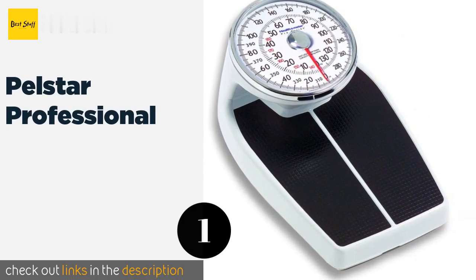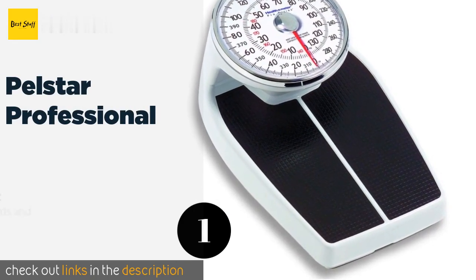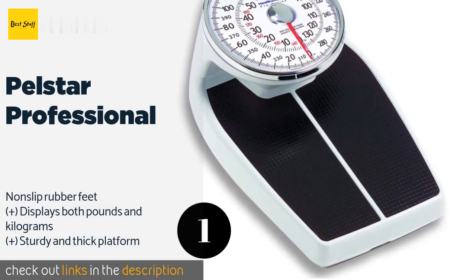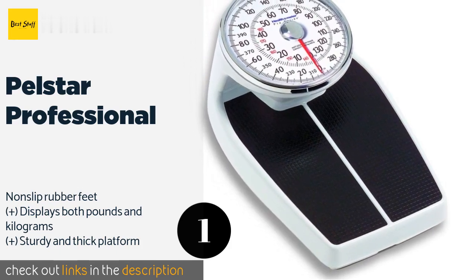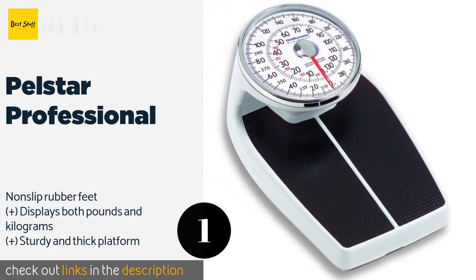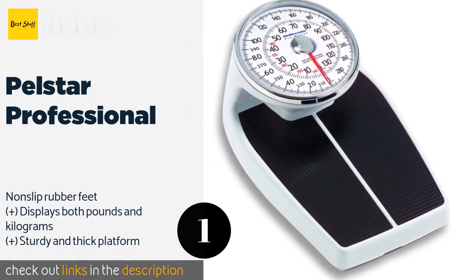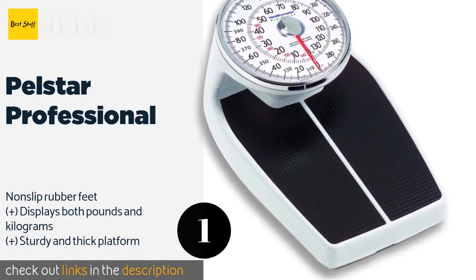Number one is the Pelstar Professional. Roomy and with a 400-pound capacity, the Pelstar Professional is a strong choice for most users, especially since it has a large face that isn't too tough to read. In fact, you may not even need to dig out your reading glasses to see the numbers. The price is around $88 — check out the product link in the YouTube description below.